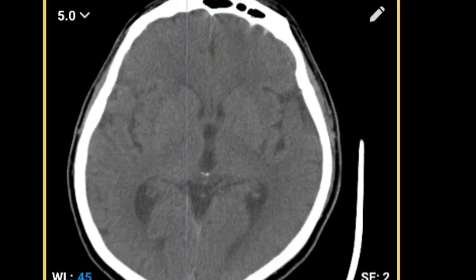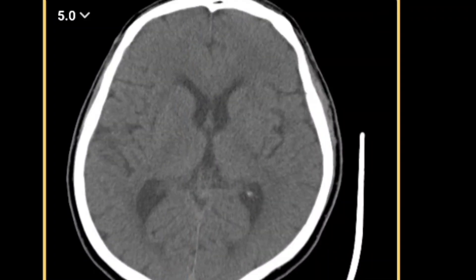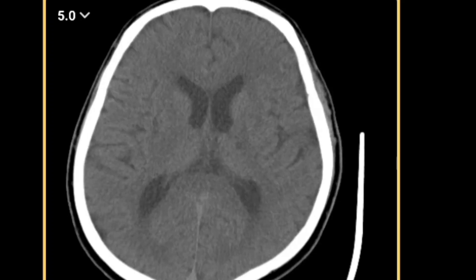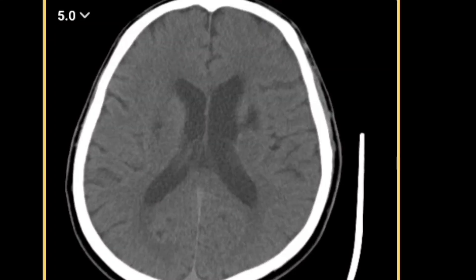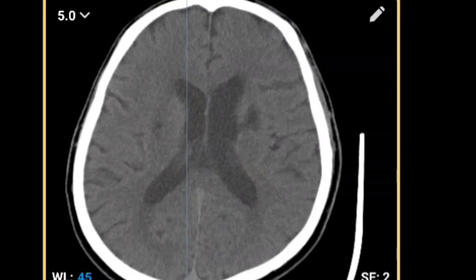In front of the sylvian fissure there is a deep buried area called the insula. Normally you cannot see the insula on CT images because it is covered by the parietal and frontal opercula, but in this image you can appreciate it to some extent. Going slightly upward, the anterior horns of the ventricles become visible, and in the area of the basal ganglia a well-defined hypodense area can be seen — this is basically an ischemic infarct.